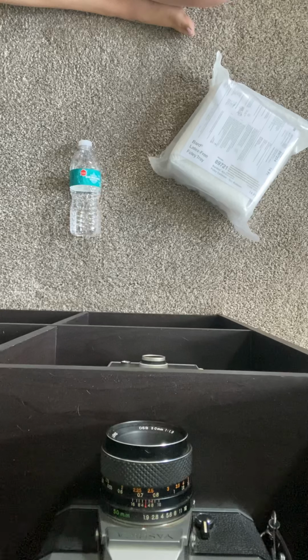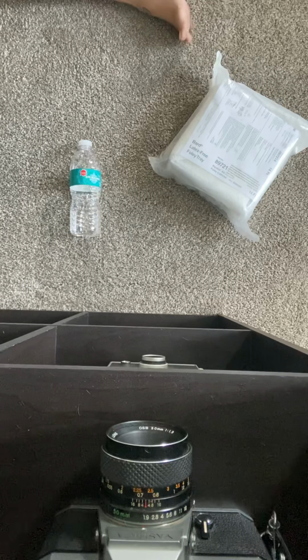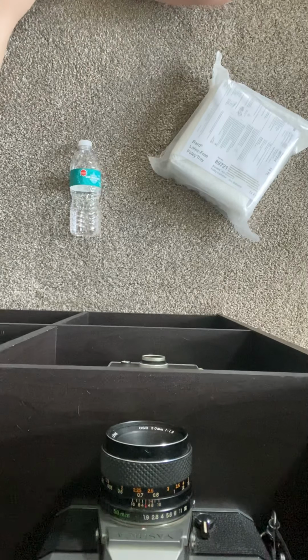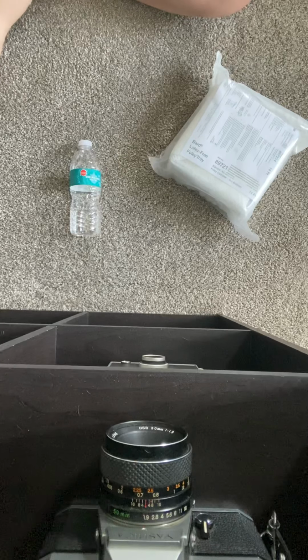I am going to kind of drape my patient. So I want to keep everything else covered and then at least the top half. If I have a female especially, I don't want to just take everything off. So she will have to have her legs kind of open. Obviously I won't be able to drape lower extremities because everything needs to be clear, but the top half you can at least drape.